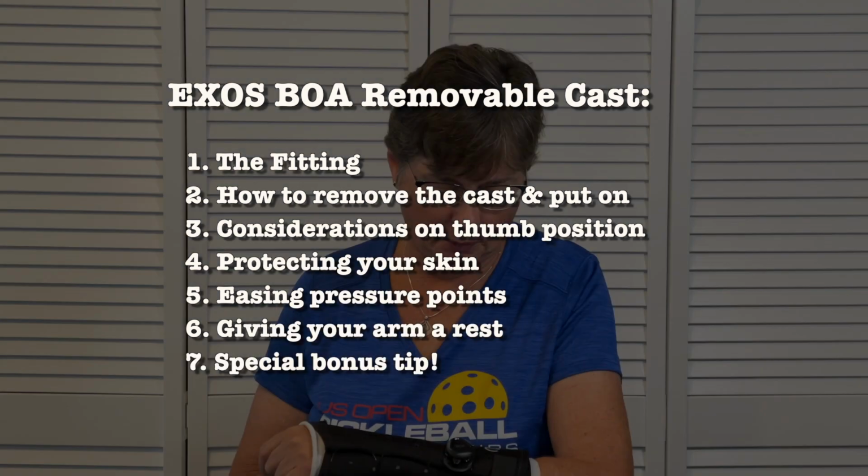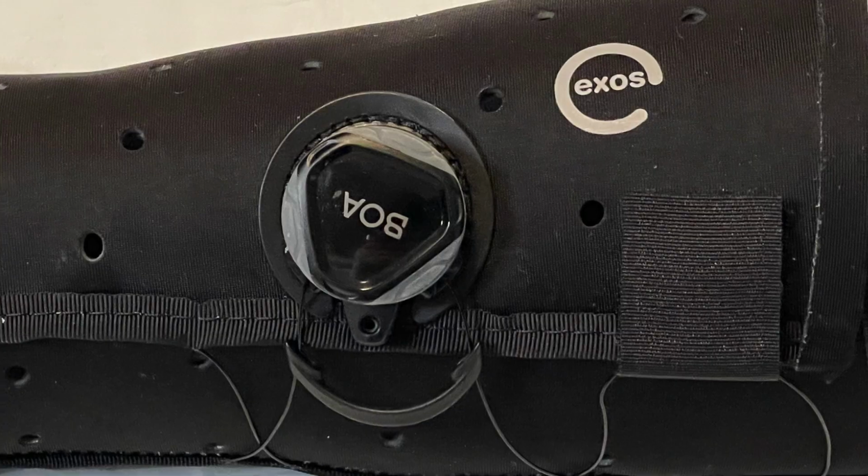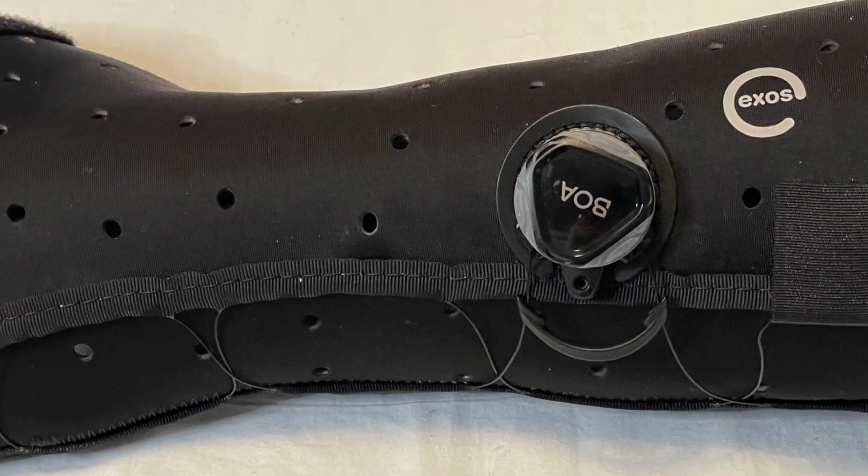So this EXOS BOA was fitted in the doctor's office, and I wanted to give you a little background as to what they do on it. They warm it up in a specialized oven. It gets to about 200 degrees, and they leave it in there for about 5-10 minutes until it's just slightly softened. And then they slide it on your arm and shape it to your hand while you are in the office.